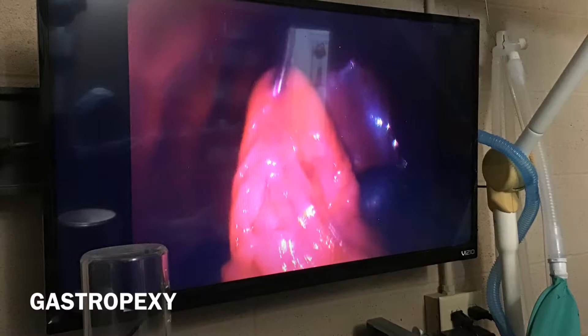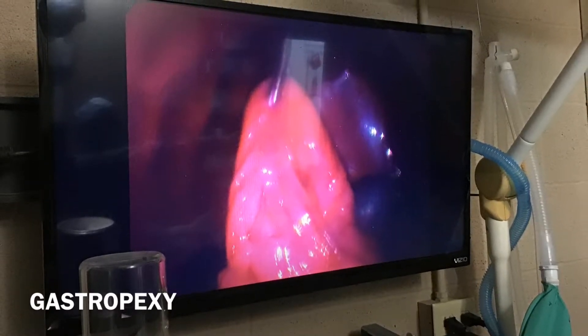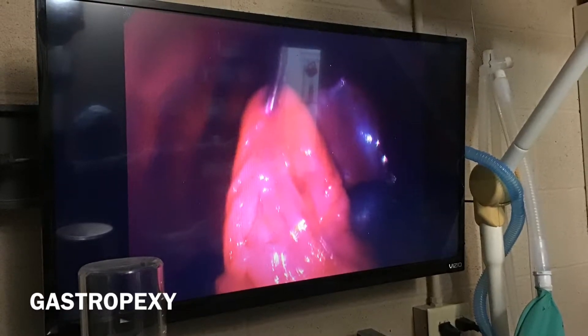Here we pull the stomach up to the abdominal wall and secure it with suture to prevent it from flipping onto itself, which can be life-threatening.